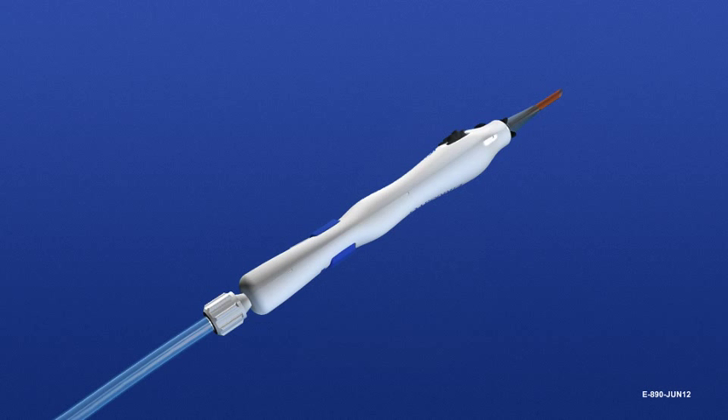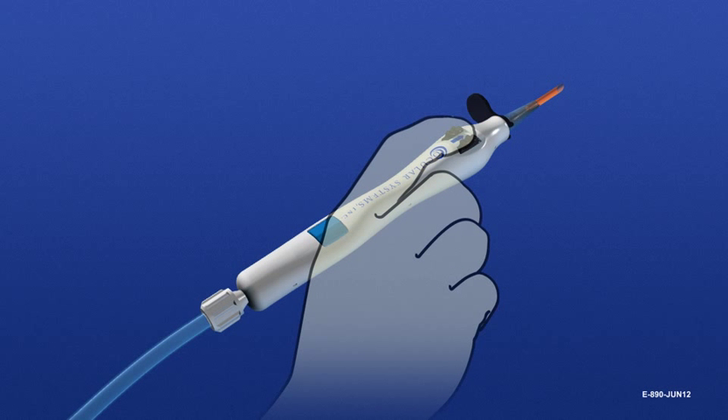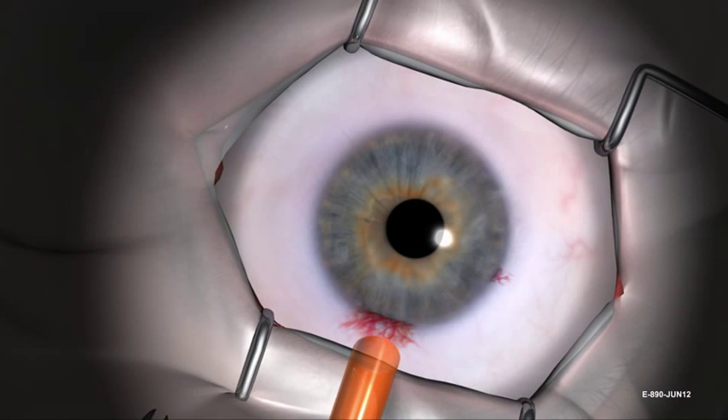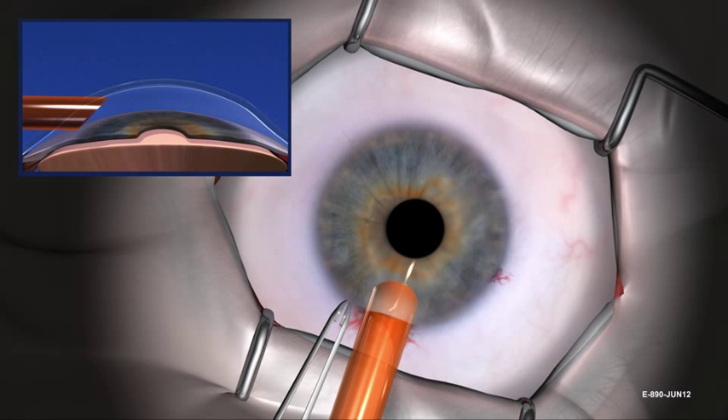Roll the device 180 degrees so that the black deployment wheels and Ocular Systems ink face up. Firmly hold the black deployment wheels in position and gently remove and discard the locking guard. Continue holding the black deployment wheels while inserting the beveled tip of the insertion sheath through the tight 4 millimeter incision. The deployment wheels must be held securely throughout the insertion process to avoid damage to donor tissue during insertion.